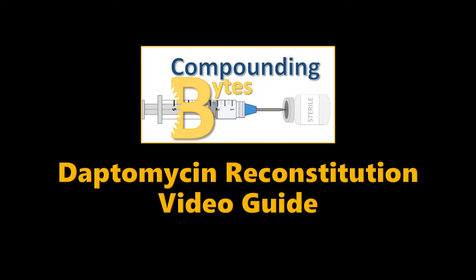In this video, we will demonstrate how to reconstitute daptomycin vials effectively and efficiently. Please see our tip sheet on SharePoint for written step-by-step instructions for reconstitution.